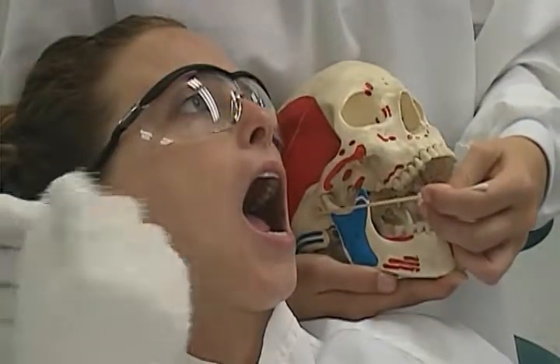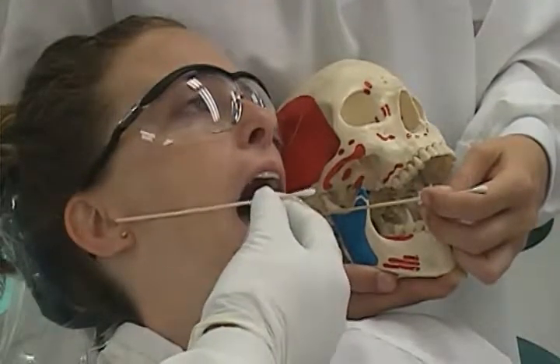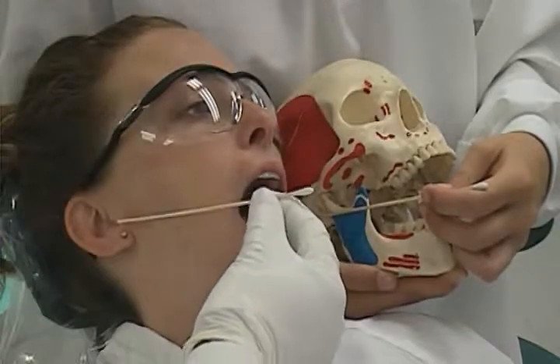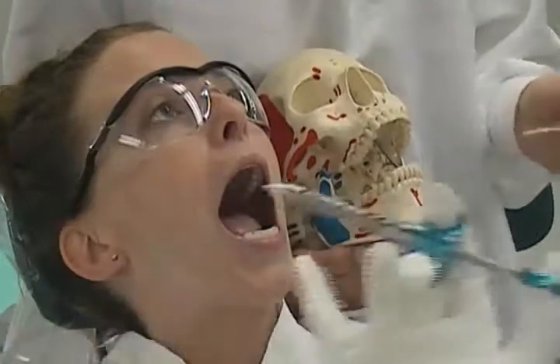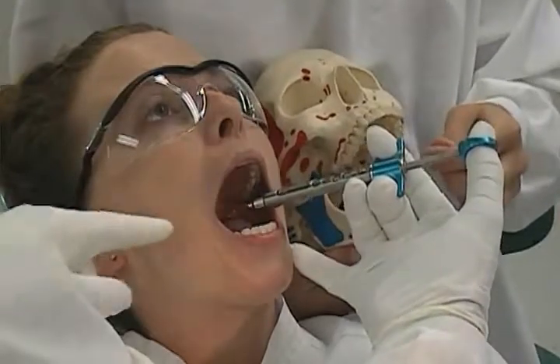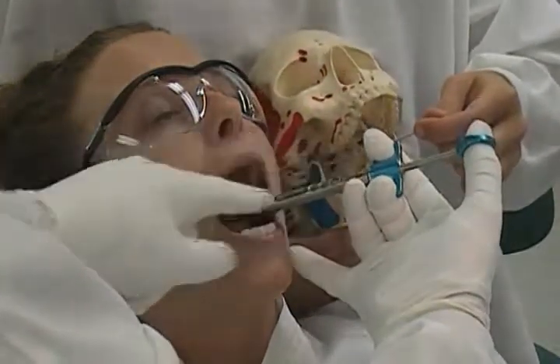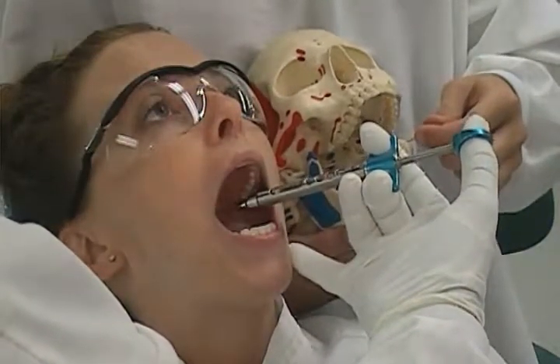Align the needle with the plane extending from the corner of the mouth to the intertragic notch on the side of injection. It should be parallel with the angle between the ear and the face. Direct the syringe towards the target area on the tragus.